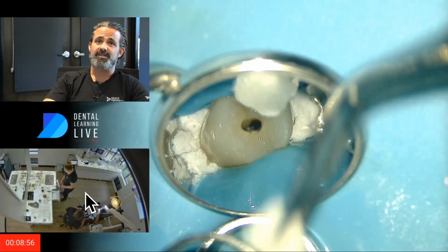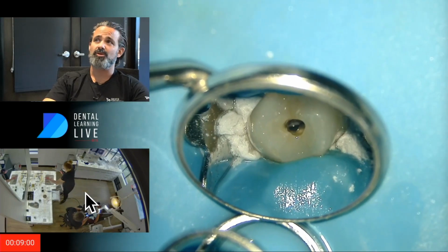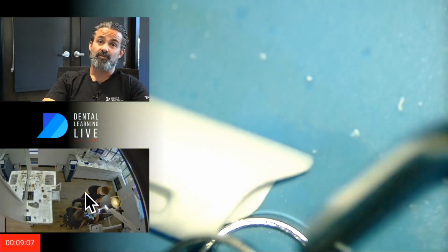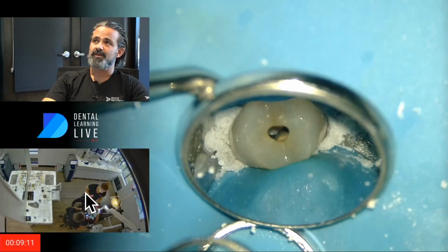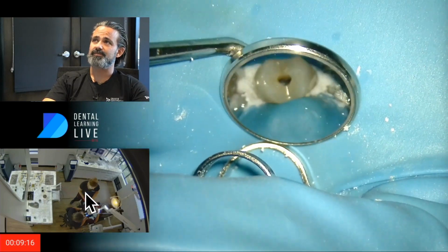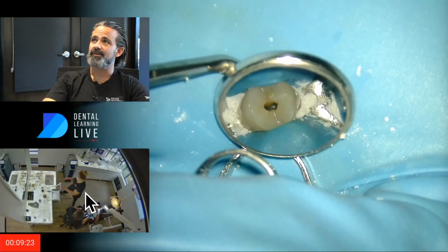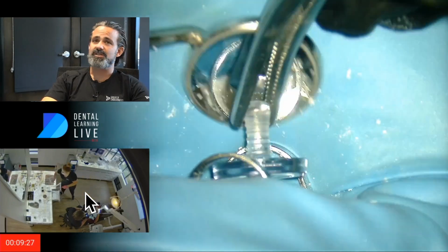And now I'm going right to the GentleWave. So I'm taking alcohol, cleaning the environment, very important. I don't want any protein, pellicle protein, plaque on the tooth or crown, and I'm just drying everything up. I don't want any residual hypo or anything like that around the tooth, just so that the sound seal really sets nicely. Great. All right, so now here it goes, and this is what I was describing.